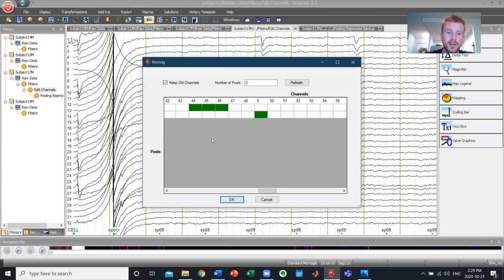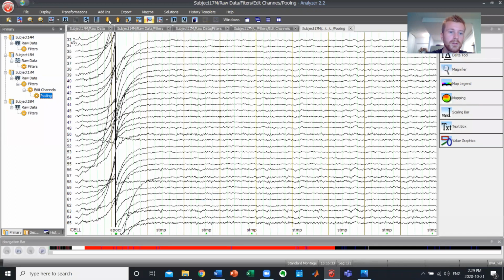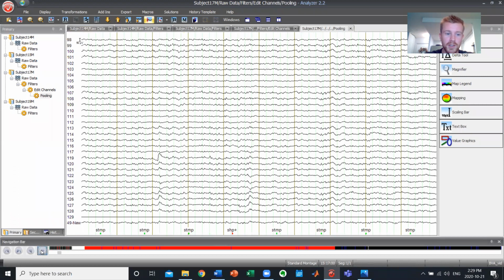So once we do this, we're going to make sure we keep the old channels, and we're going to apply this step. Now we can see pooling has come up here, and we can see that we have these new channels. Let me go down. They should be at the bottom. Yep, perfect. 118 new and 49 new. So these are the new channels that are just interpolated versions from their surrounding channels.